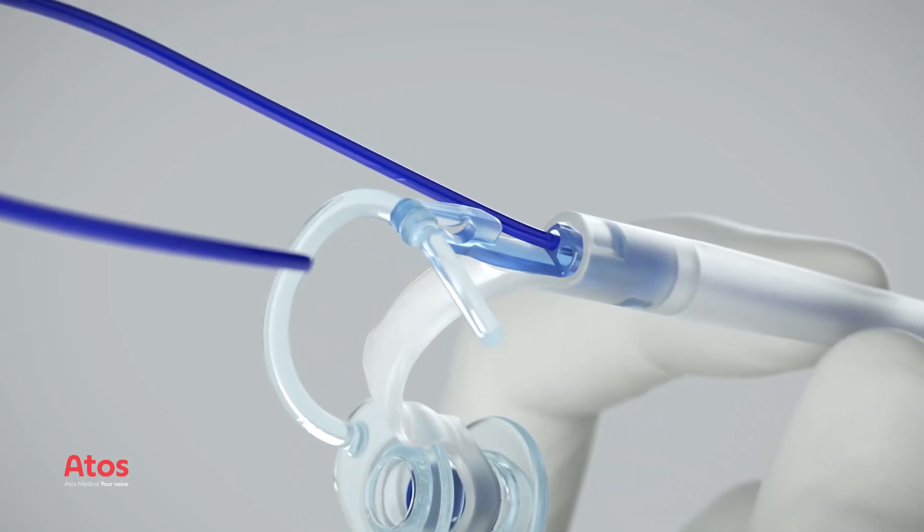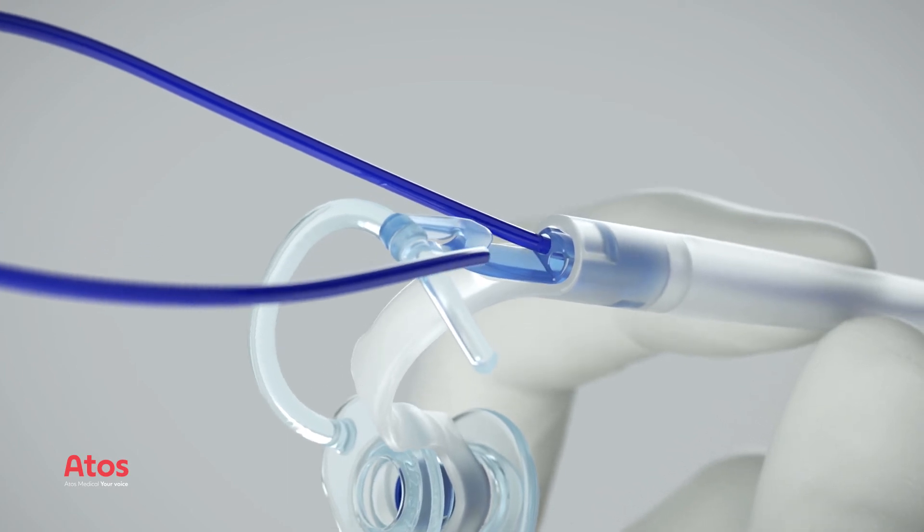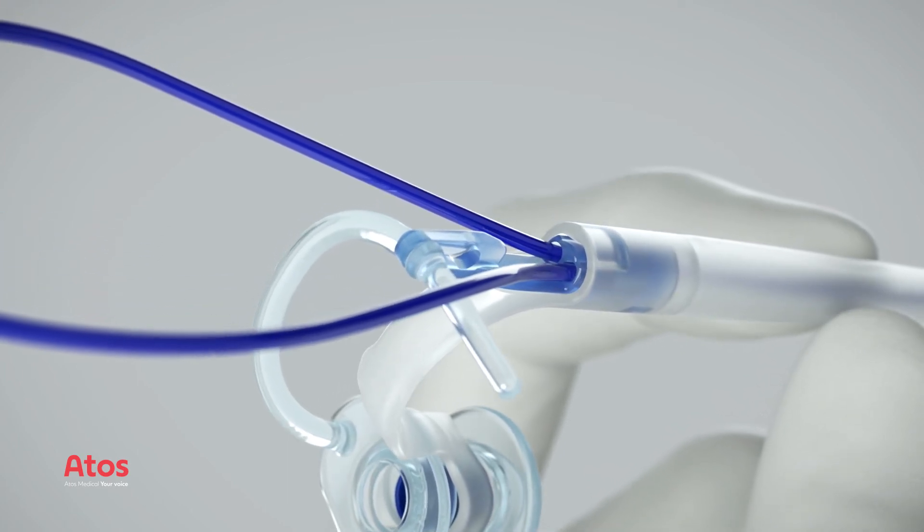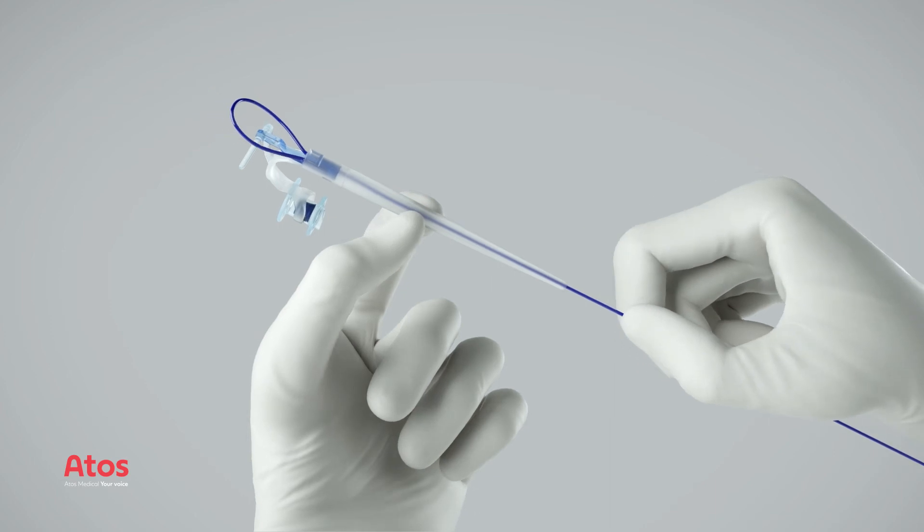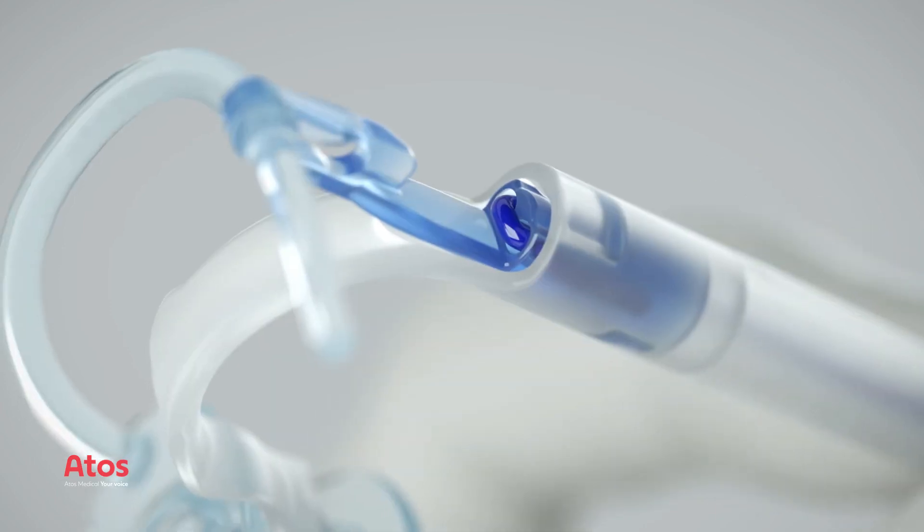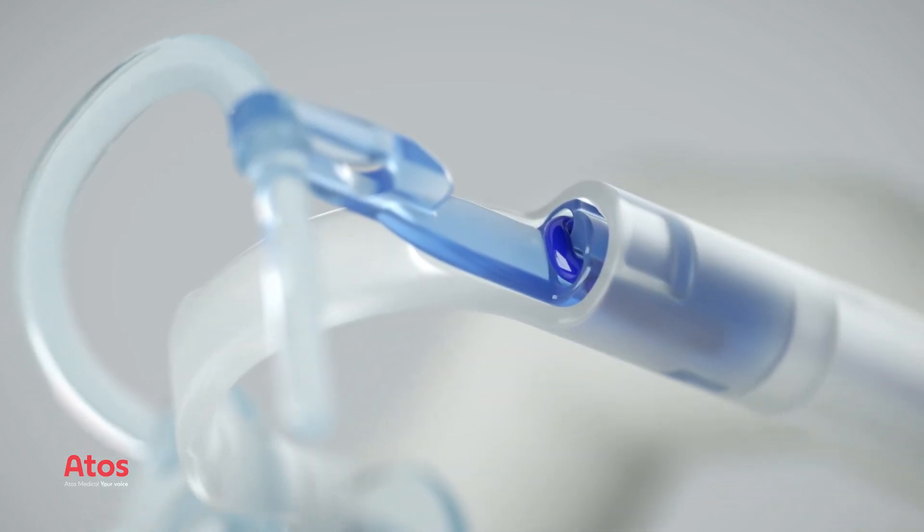Grab the tip of the guide wire and insert it into the hole next to the exit hole of the puncture dilator. Tighten the guide wire and verify that it is secured to the puncture dilator.